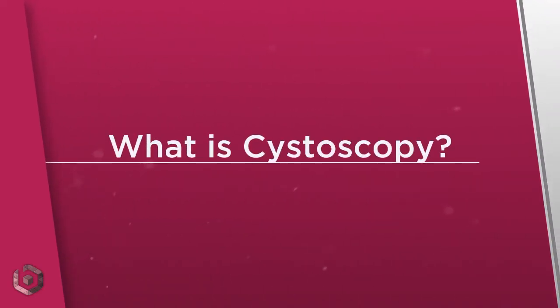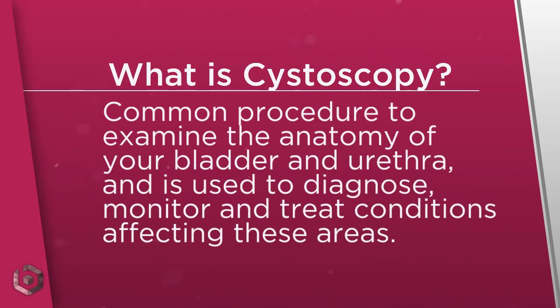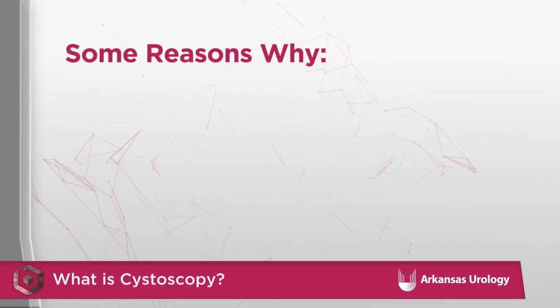What is cystoscopy? Cystoscopy is a common procedure that allows your physician to examine the anatomy of your bladder and urethra and is used to diagnose, monitor, and treat conditions affecting these areas. There can be many reasons why your physician has recommended a cystoscopy.